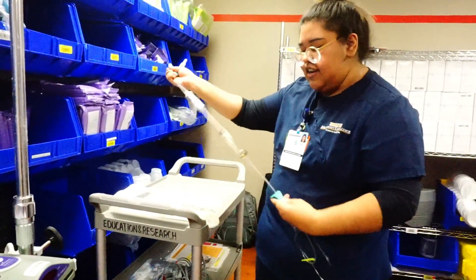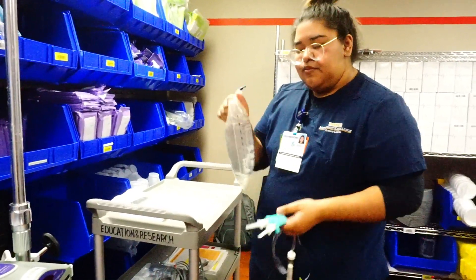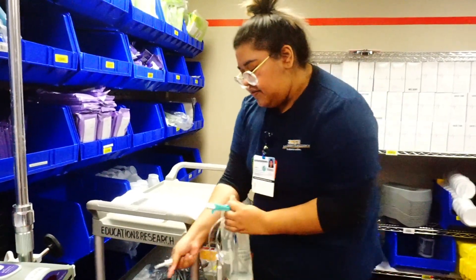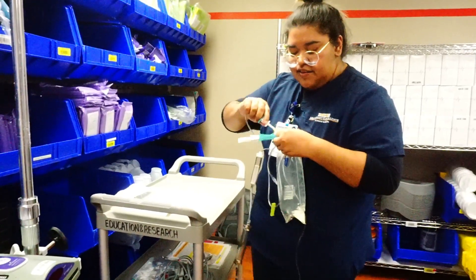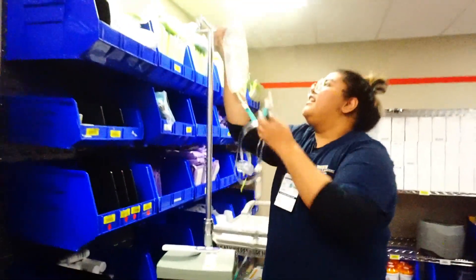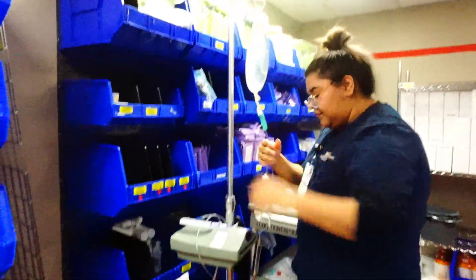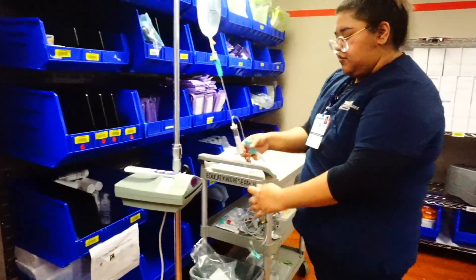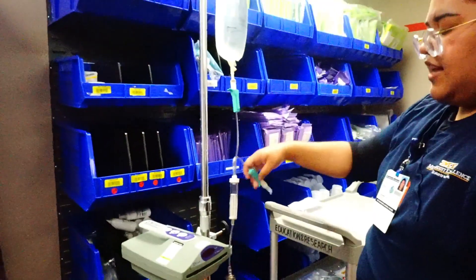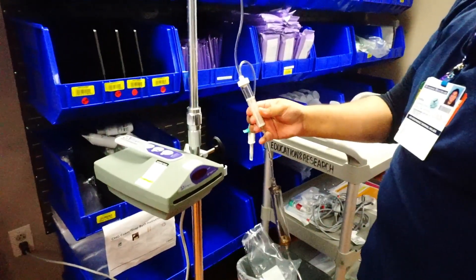What I'm doing here is locking everything, because whenever I spike this tubing I don't want it to just flow right through. Now we'll go ahead and spike — it doesn't matter which spike you use if you're using this gravity tubing. Obviously I would have gloves on; it's just easier for me not to right now for the video. We're going to hang here and leave the bottom lock locked. This one is locked as well, and I'm going to unlock this top one — all of this is just to prime the filter portion.